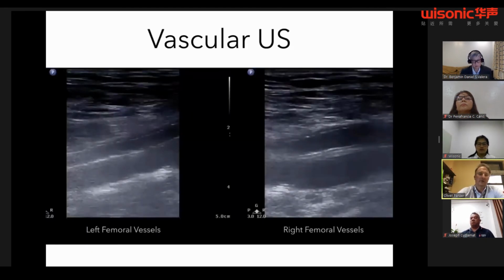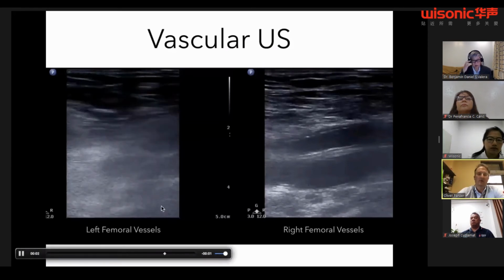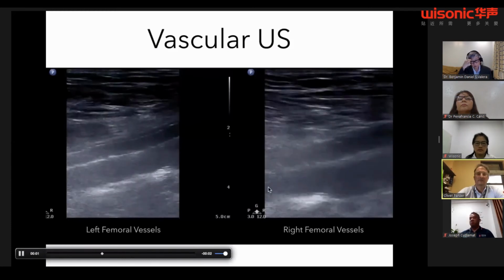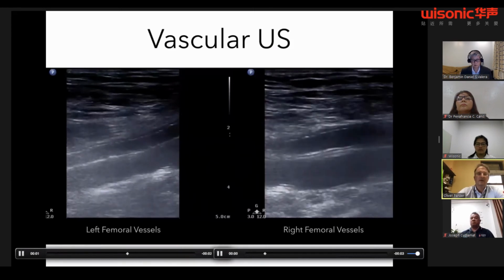And I think these patients are important because of the hypercoagulability, to quickly make an effort to look at the femoral vessels to look for DVTs. And again, there are no DVTs. This was clear here in the veins underneath the artery.